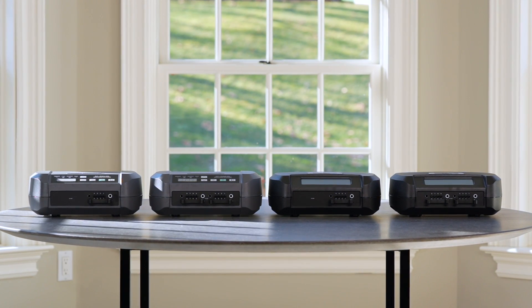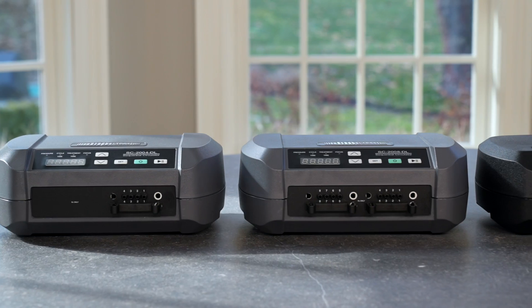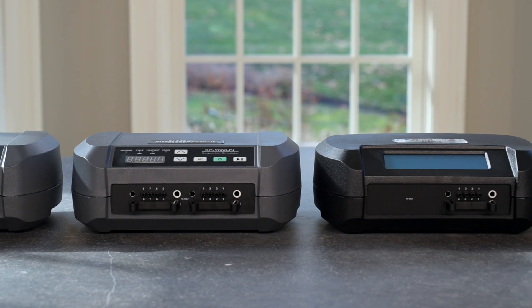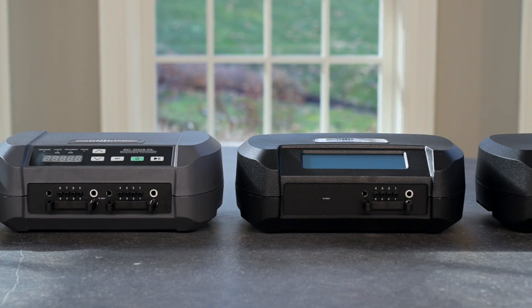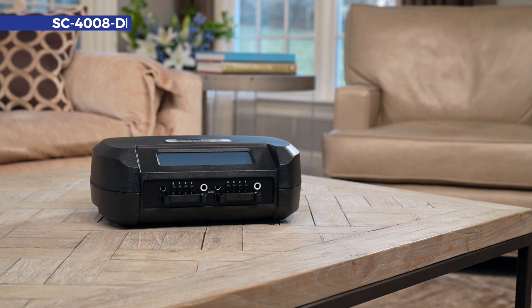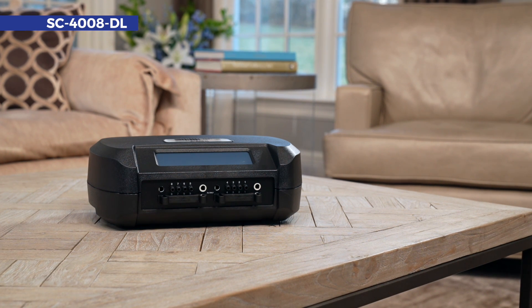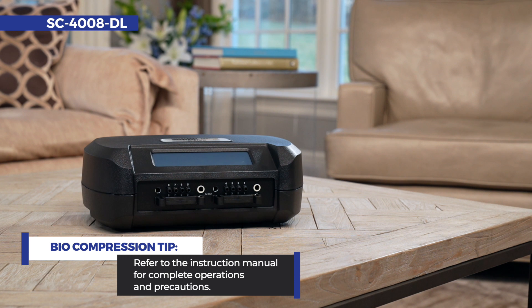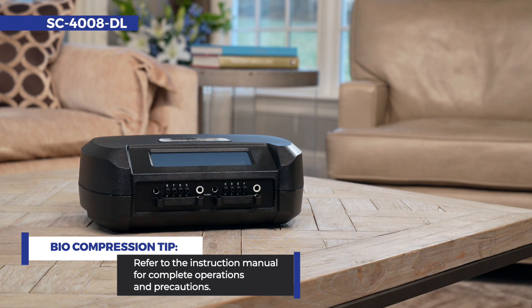Your physician has prescribed a biocompression sequential circulator for your treatment. All of our pumps are designed for home or hospital use. This video will guide you through the setup of the eight-chamber sequential circulator SC4008DL from start to finish. Always reference the instruction manual for a complete understanding of operations and precautions for your pump and garment.